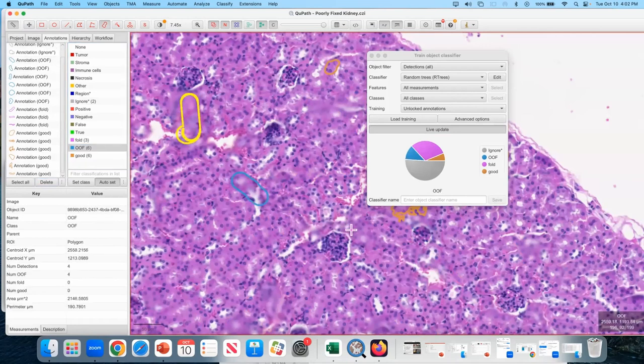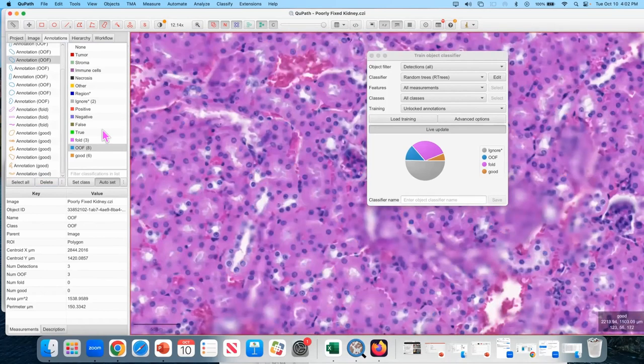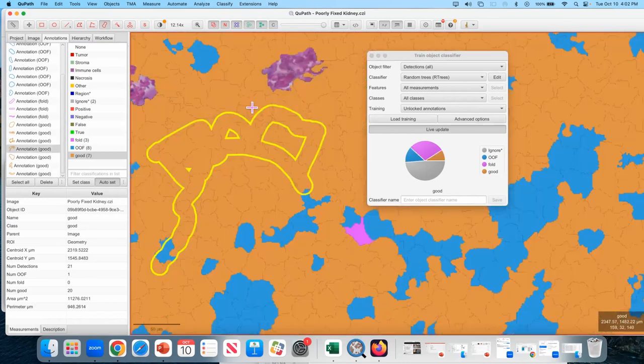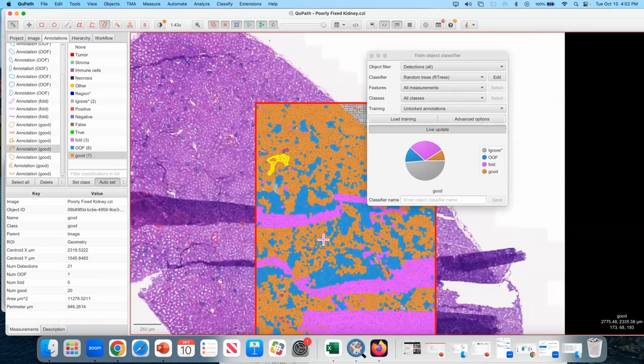Focus. That looks okay. If I had like 20 minutes, if I had like 4 minutes, I could get this pretty nice. If you look real hard on YouTube, you can find videos of me doing this.